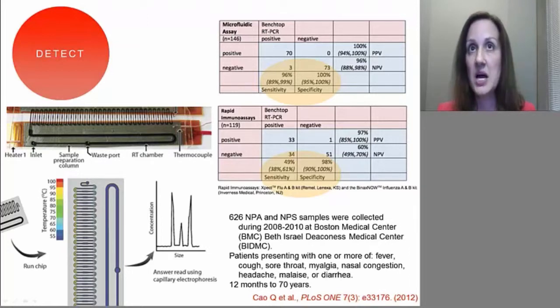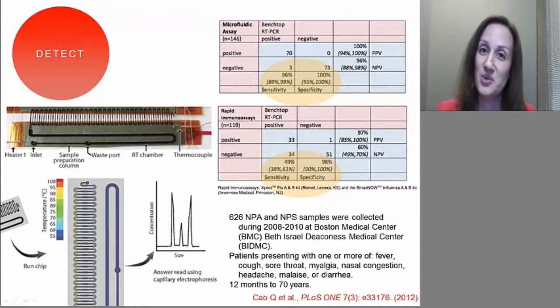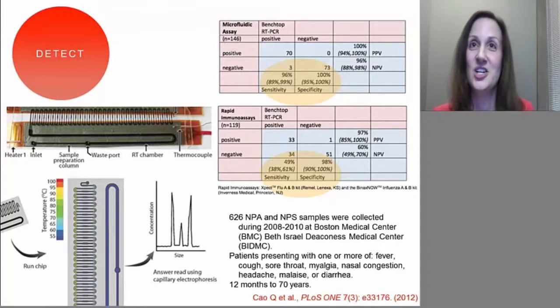You'll see from this plot that in our data, we only had 50% sensitivity using the lateral flow strip tests, the protein-based test for influenza A and influenza B. The specificity was high, but the sensitivity was low. And when you hear Andy Phan's lecture, you can review what sensitivity and specificity mean before class.